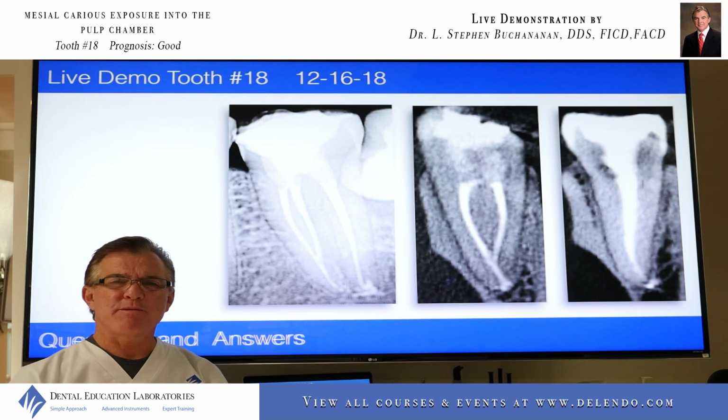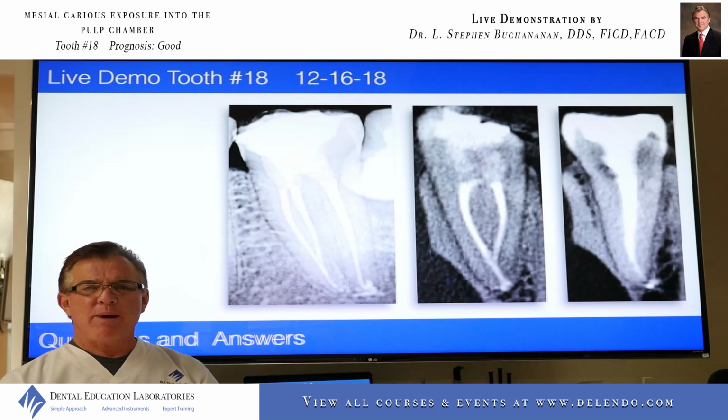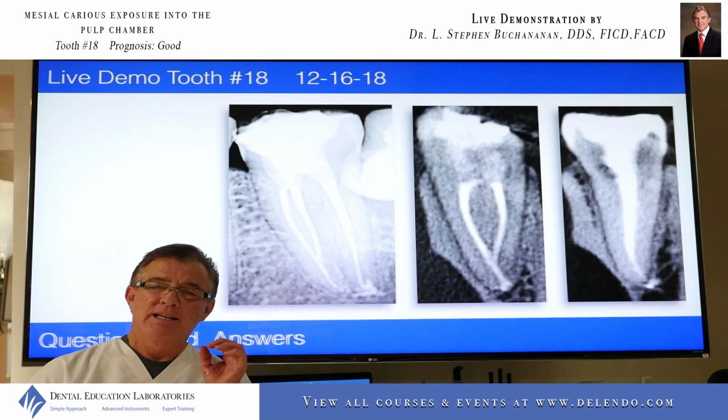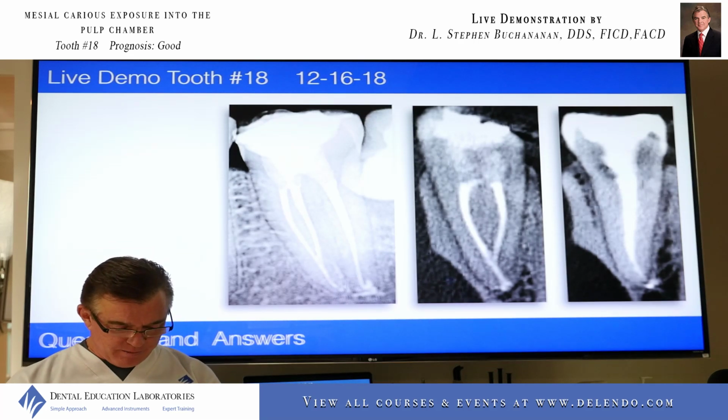And one of the interesting things about that sealer to me is it's biocompatible to patient tissues, and it's highly antimicrobial because of the small amounts of calcium hydroxide that are liberated upon its set.